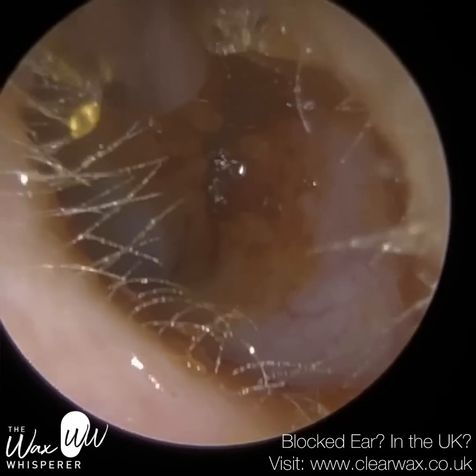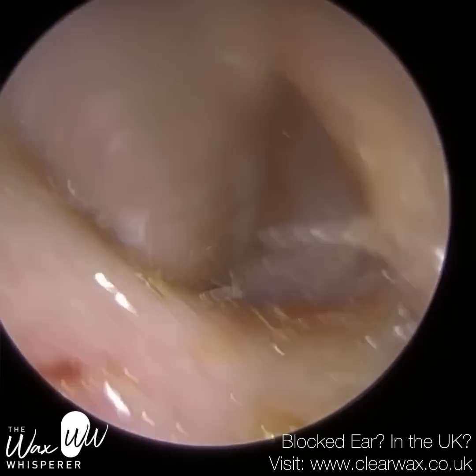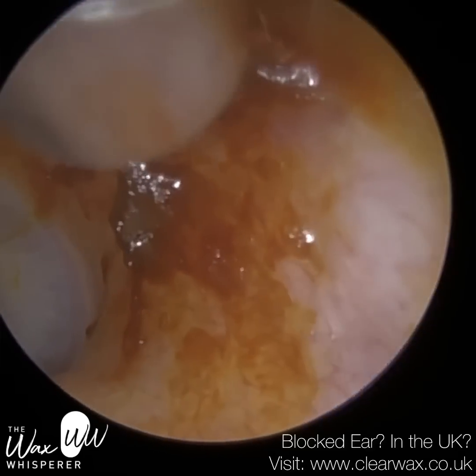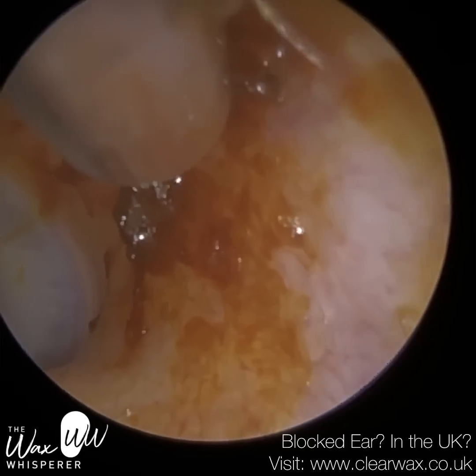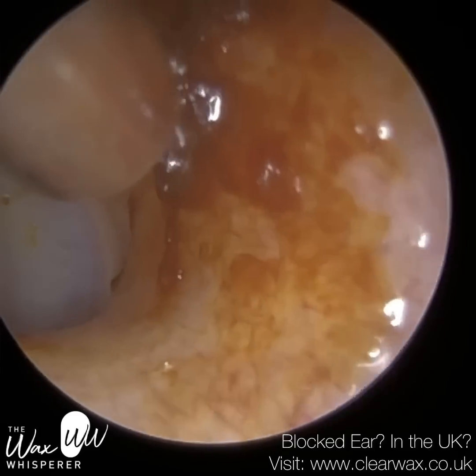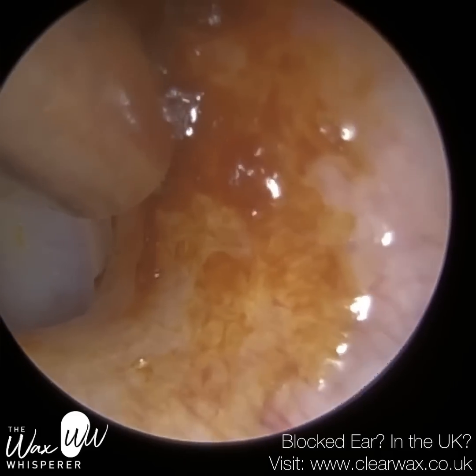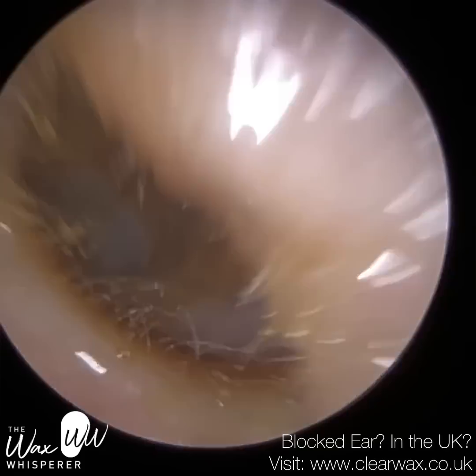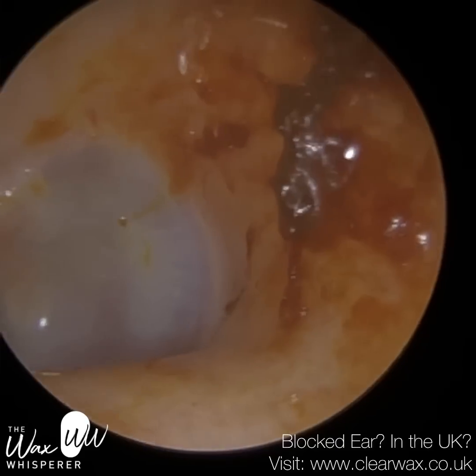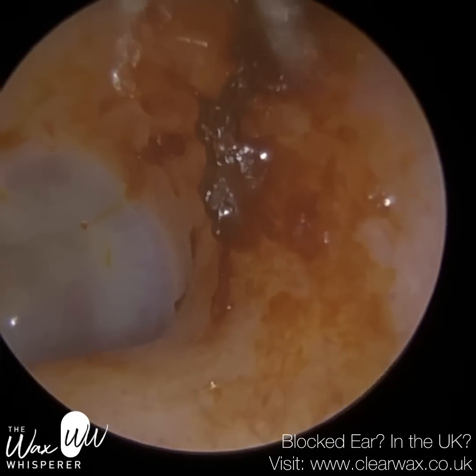So a type 6 would be when the edges are quite mushy. So they come out in small blobs, but type 5 is when they're clear-cut edges, and the type 6 is when it's mushy, so it's rough around the edges. So the reason I'm saying between a 5 and 6 is because the pieces on the tissue resemble the type 5, but obviously I vacuumed a lot of it up as well, so that's more the mushier stuff.